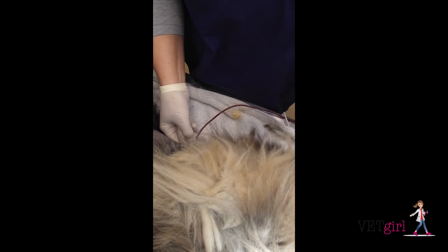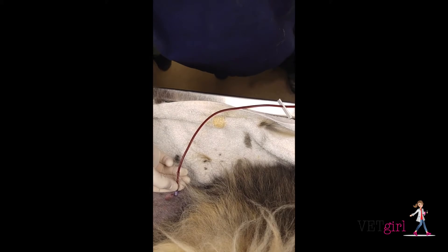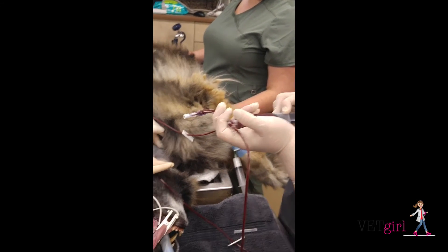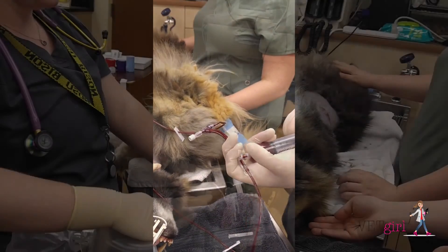The patient was then gently rocked back and forth after the procedure, making sure that the endotracheal tube is disconnected to prevent tracheal injury, and the dog recovered well. In this case, autologous blood patch pleurodesis was safe and effective in treating and resolving the pneumothorax.